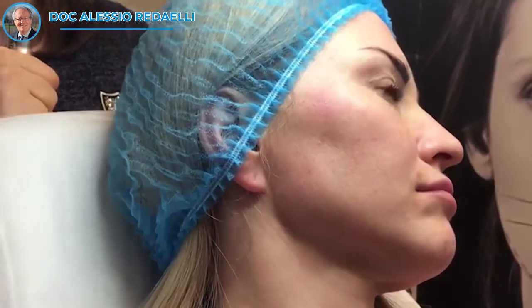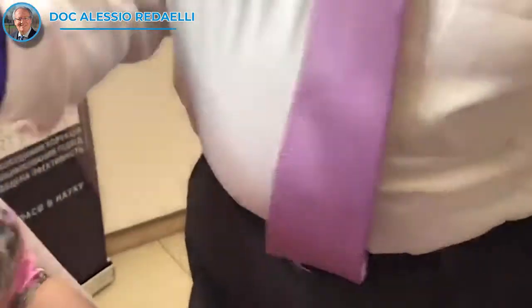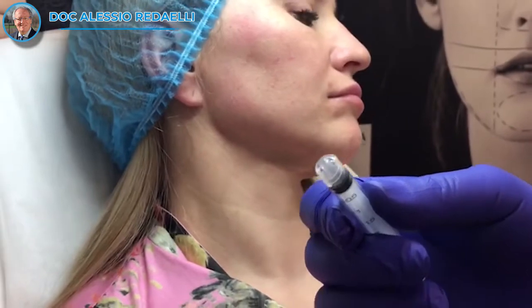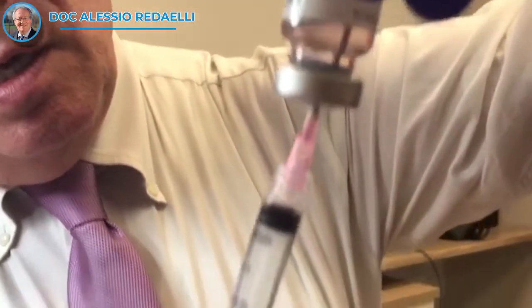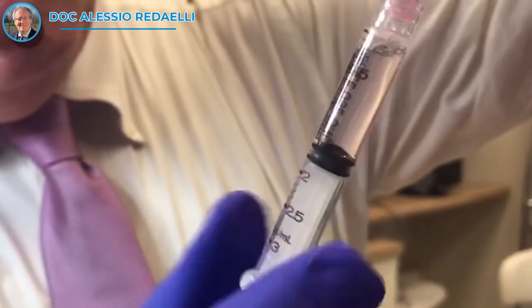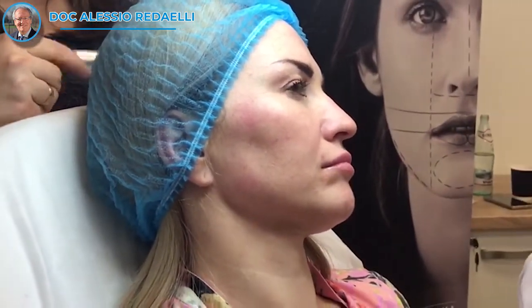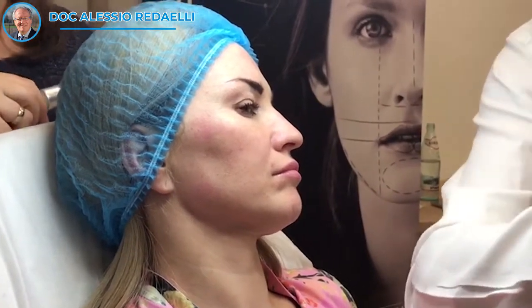Perfecto, very good. Give me this, we close. NCTF — very good — and we take again one ml. One ml, not so much. When you have more experience you can inject also one and a half when you distribute well in the face.